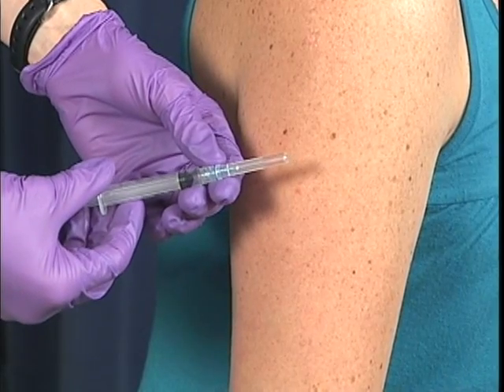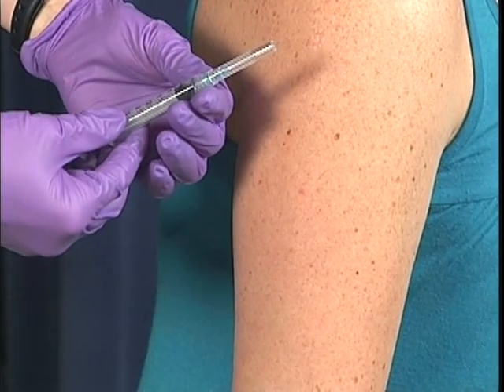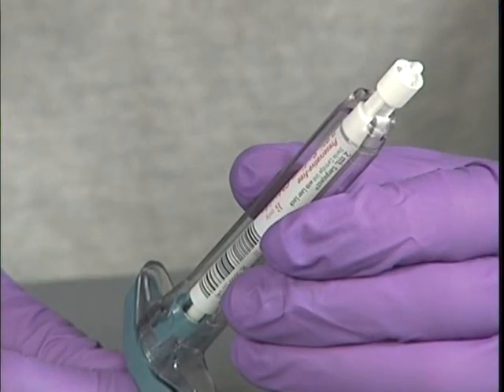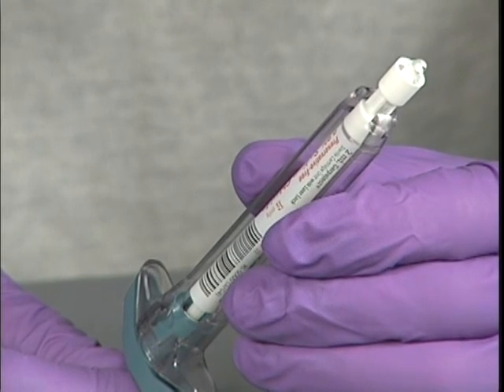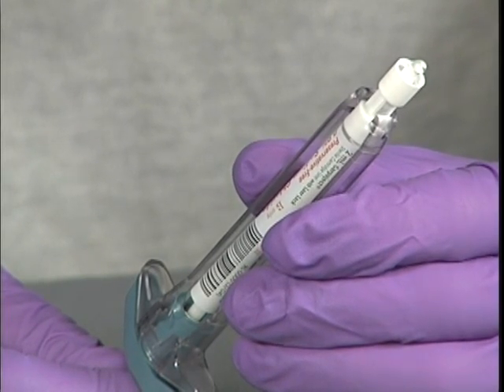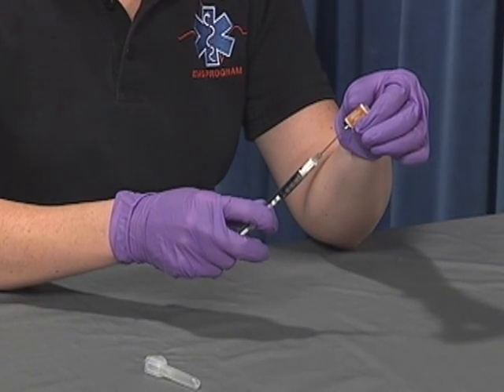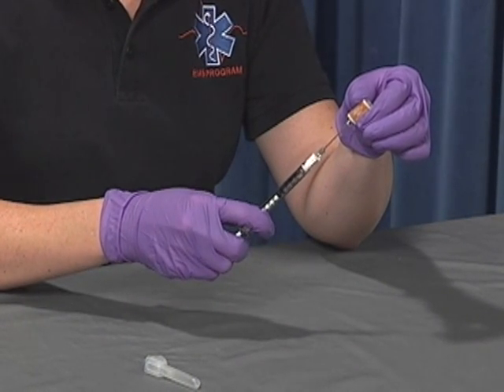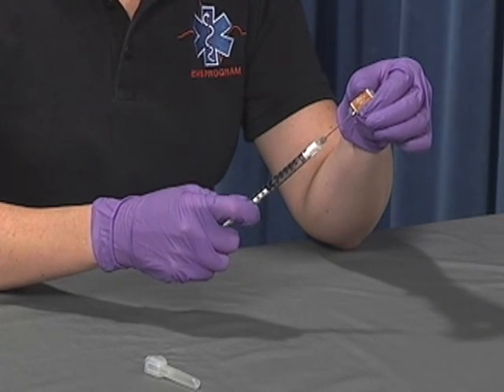Route of administration and size of the patient are used to determine the appropriate size needle. Pre-filled systems may have an air bubble that needs to be purged prior to medication administration. When drawing up medication from a vial or ampule, draw up a little extra volume that can be wasted when purging air bubbles.